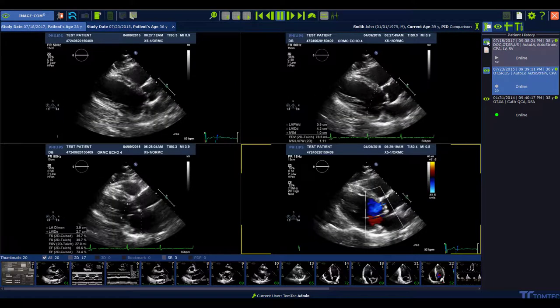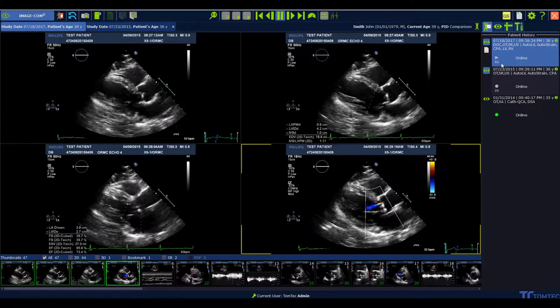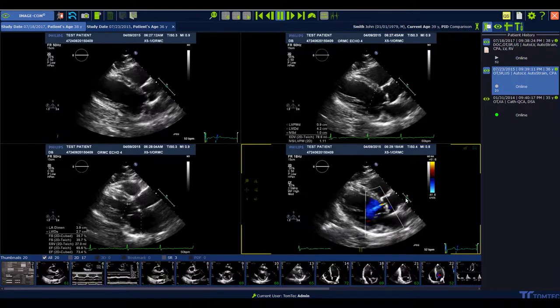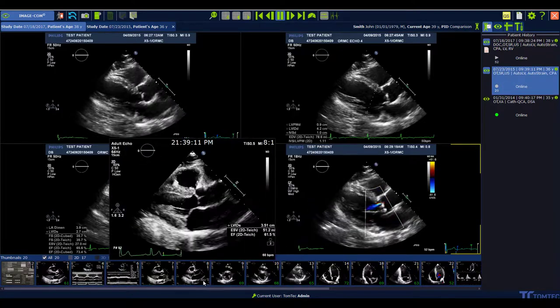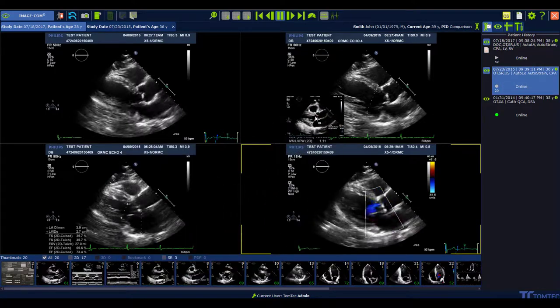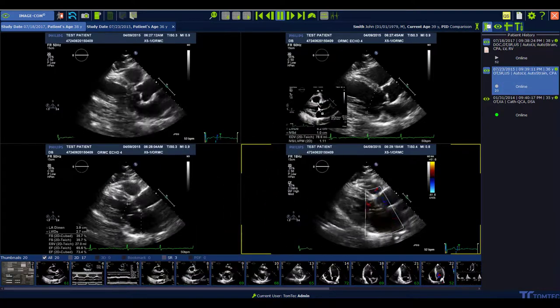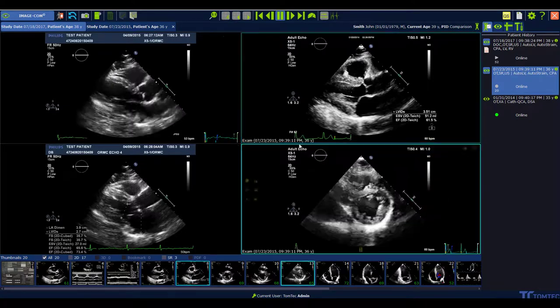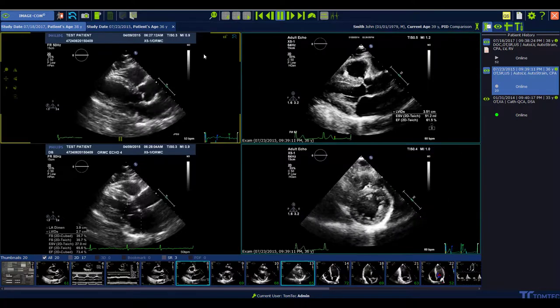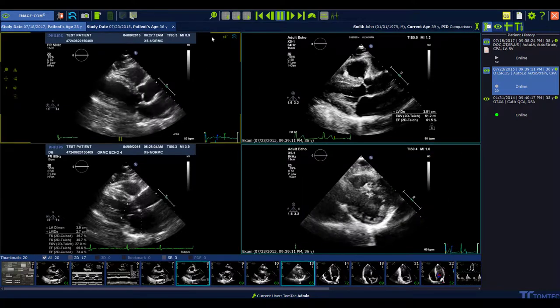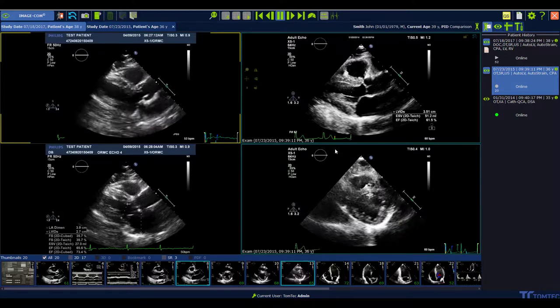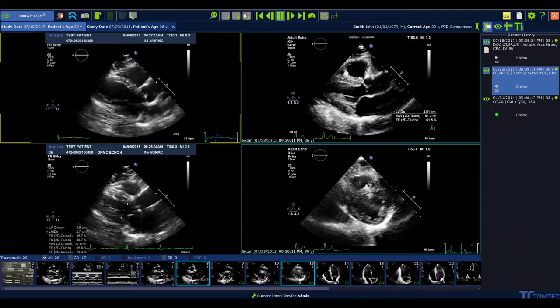You can also load the active study and load the old study in the thumbnail bar, and now you can drag and drop images from the old study and directly compare to the new study. Now you see the new study marked by a yellow frame and the old one by the blue frame.